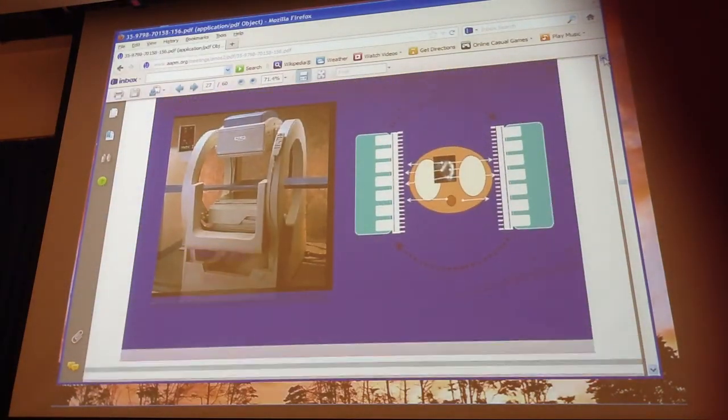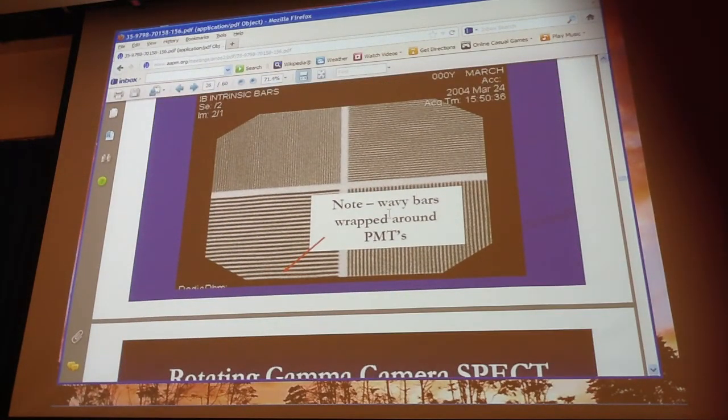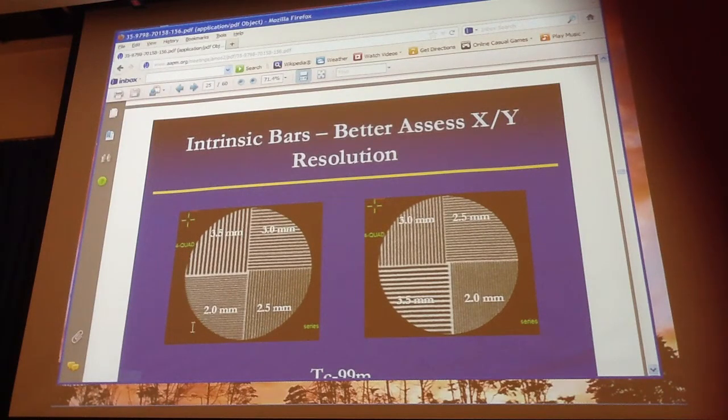Use another radioisotope with 2 different peaks, and if it's the same thing, then... Well, I'm going to give you a quicker way than that. You could turn off the pulse height selector to select only one and then do it. Okay, well, I still have the same problem, but, okay. What are the interesting... Okay, what were you saying?